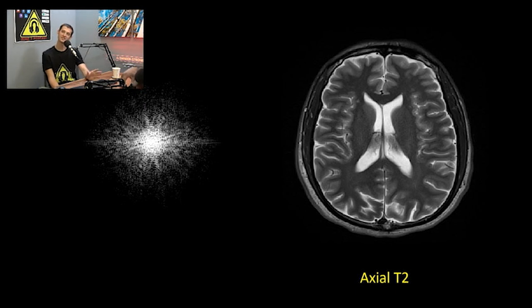So the Kspace on the left, almost all real pictures, like if you took a photograph of something and ran it through what's called a two-dimensional Fourier transform, it would look like that starburst. Basically all real pictures look a little bit like that starburst. But that is the data that the MRI is acquiring.